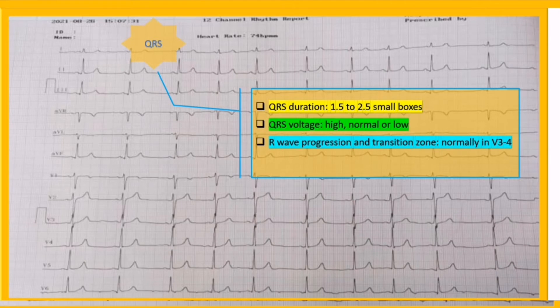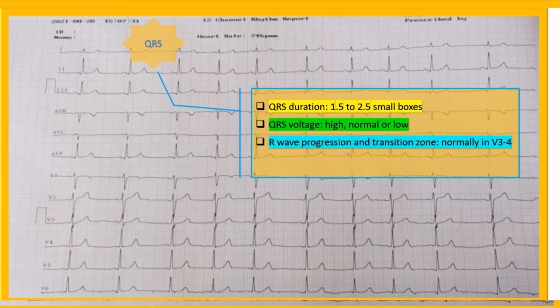The third item is R wave progression and transition zone. Normal R wave progression is defined as R wave progression across the precordial leads with transition zone in lead V3 or V4. In this strip, the transition zone takes place in lead V3 and therefore is normal. The last item is looking for pathologic Q waves.